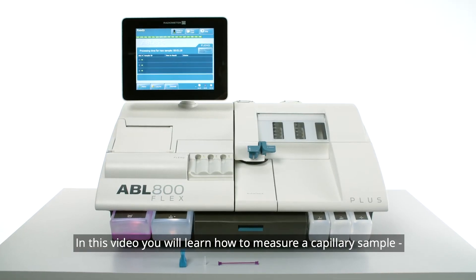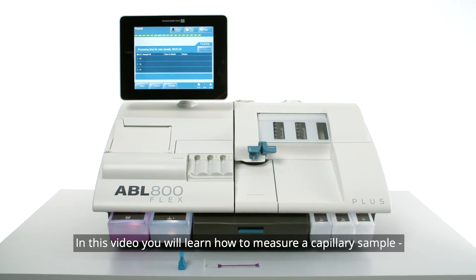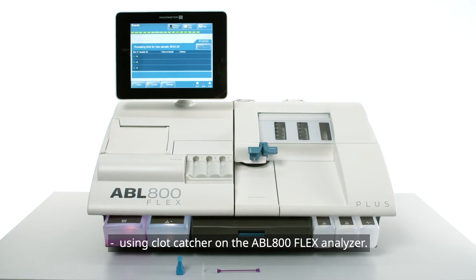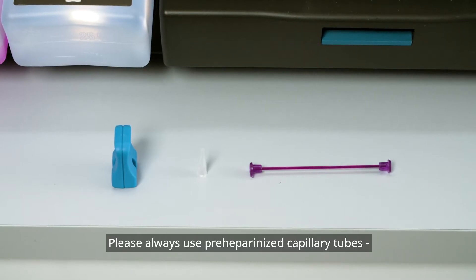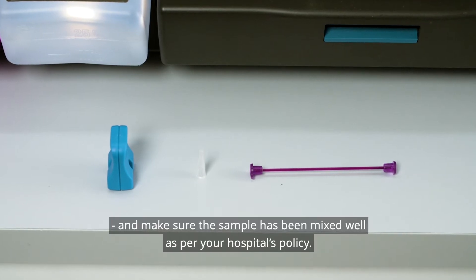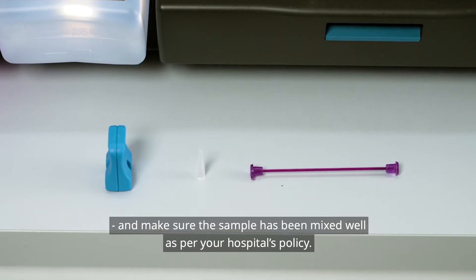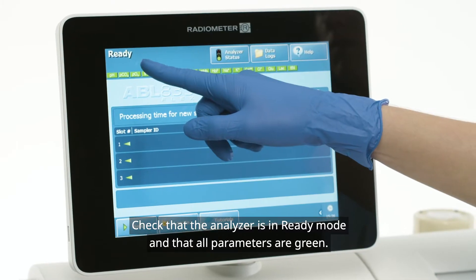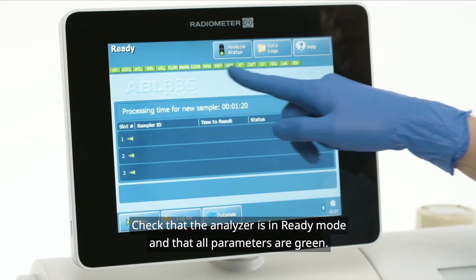In this video, you will learn how to measure a capillary sample using the clot catcher on the ABL 800 flex analyzer. Please always use pre-heparinized capillary tubes and make sure the sample has been mixed well as per your hospital's policy. Check that the analyzer is in ready mode and that all parameters are green.